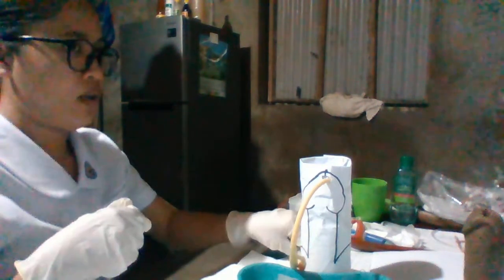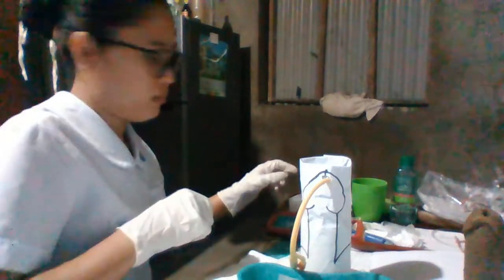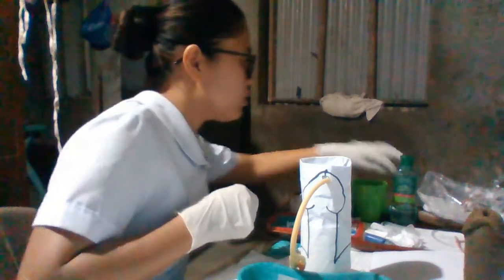Then afterwards, place excess coil of tubing on the bed and fasten it to the bottom sheet with a clip from the drainage set, or with a rubber band or safety pin. Afterwards, we're going to remove gloves and dispose of all equipment that was used.